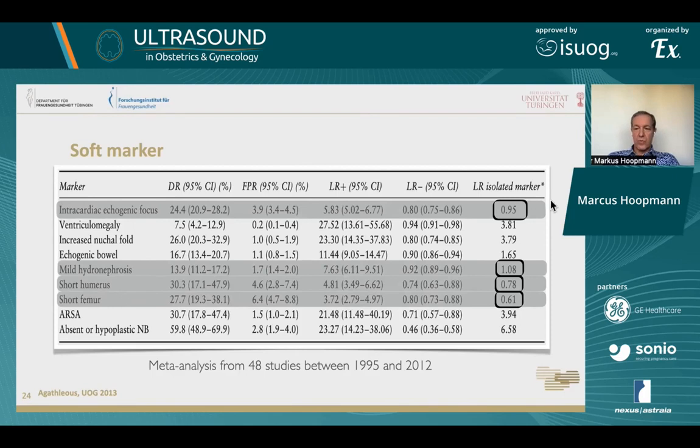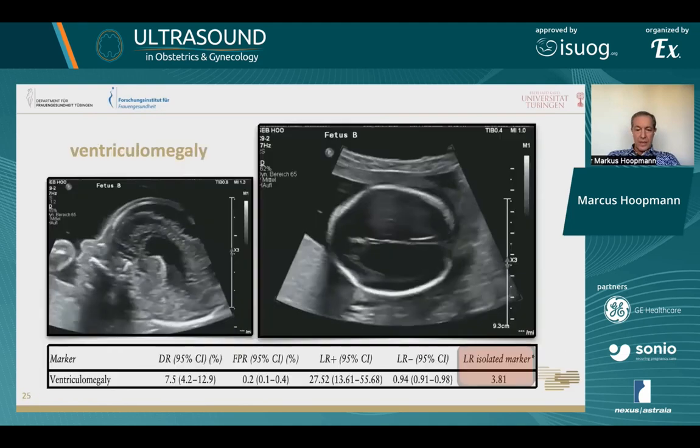And then it's very important to look at what the importance is if it's isolated. And here you can see it's not important. It doesn't increase the risk. Okay, then we can focus on the others.